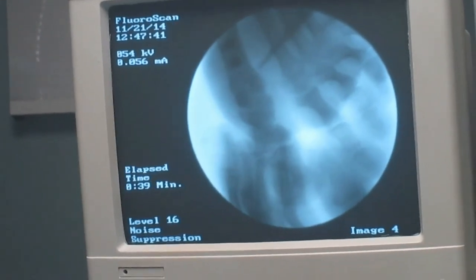You see we're marking exactly where we go on the C-arm. So we got our mark in here. We're gonna make our stab incision here. We're actually distal to our previous fixation, which is kind of important, so you gotta know exactly where you're at. We're just gonna make our incision down to the bone here and hit on our bone right here.